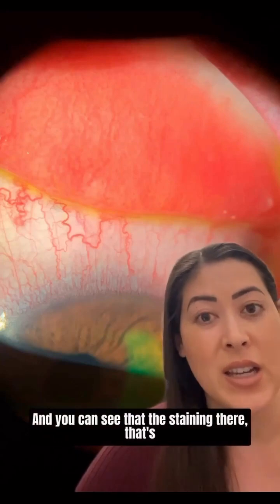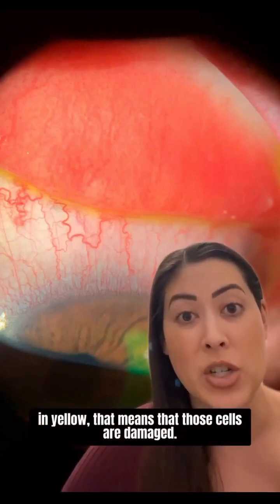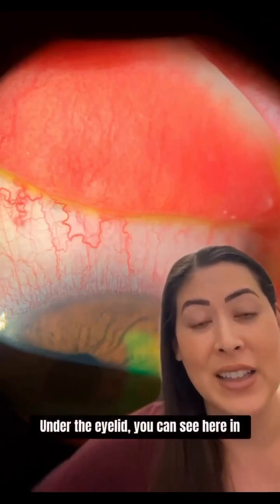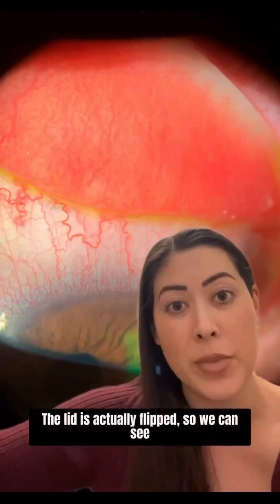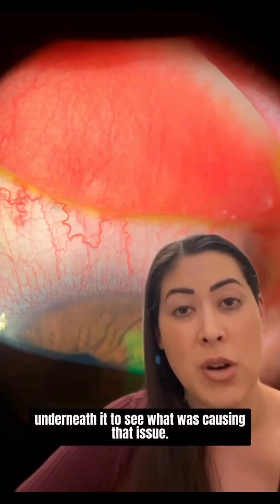You can see that the staining there in yellow means that those cells are damaged and we're going to need to do something to help heal those up. Under the eyelid, you can see here in this pink area — that's underneath the lid. The lid is actually flipped so we can see underneath it to see what was causing that issue, and it's also really inflamed and irritated.